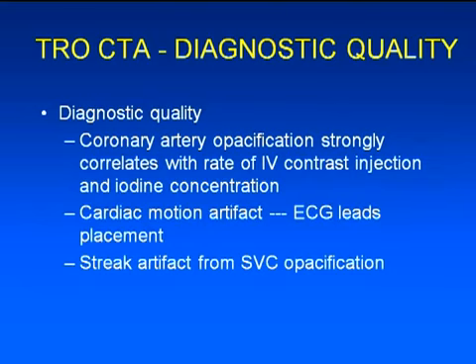In terms of cardiac motion, you don't want that at all, so make sure you position your leads correctly. You may have to go in the room. What you want is to have a very sharp, tall R wave peak, so the scanner can perceive when the R wave comes and can acquire in exactly the same place.